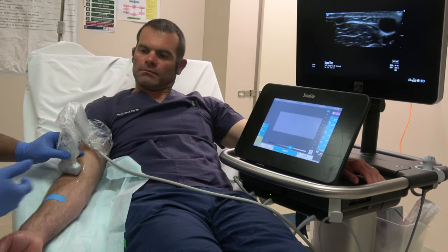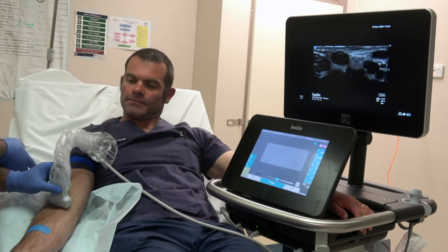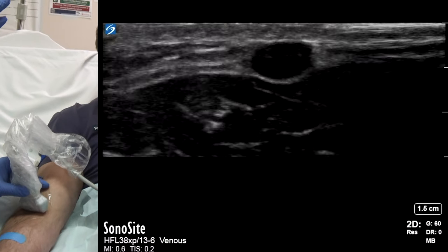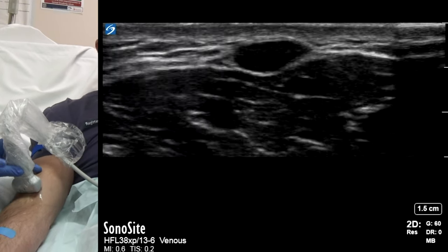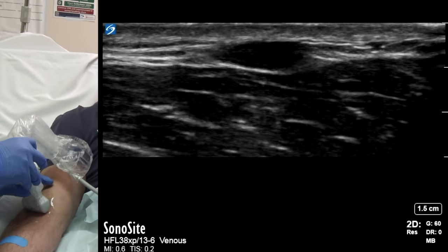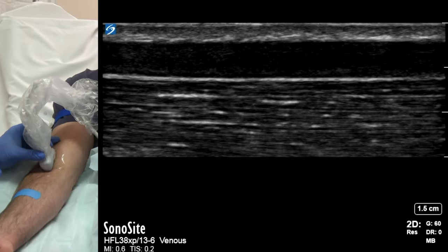Ensure that your position allows a direct line of vision of the screen and the site of insertion. Tighten the tourniquet. Keep the vein in the middle of the screen. Match the distance of the site of insertion from the probe to the depth of the vein. Slide the probe to assess the direction of the vein.